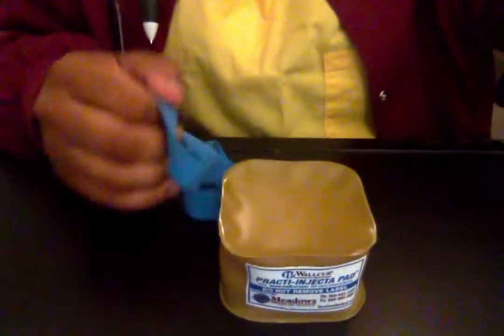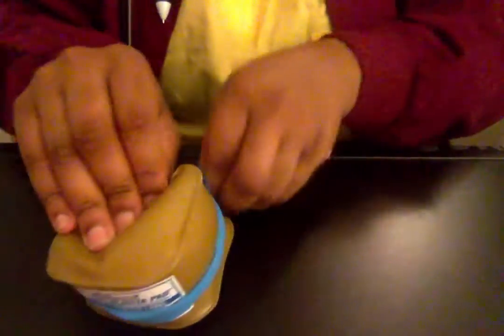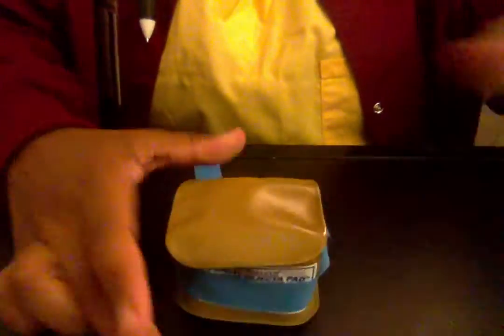And with this, I'm going to have her put her arm in the dependent position, just placing it down low so I can have the blood rush. And while she's doing that, I'm going to take an alcohol swab and have my alcohol swab sitting. And then in my little IV kit, we got a small tourniquet. So I'm going to go ahead and take my tourniquet and put it on my patient, but I don't have an arm today, so we're just going to put it on here as if I am applying the tourniquet on the arm. So we have our tourniquet there.